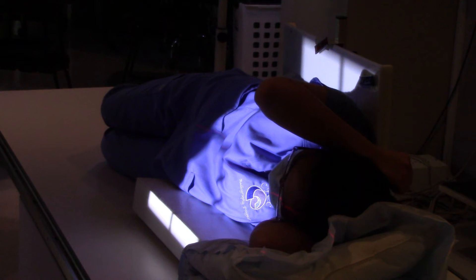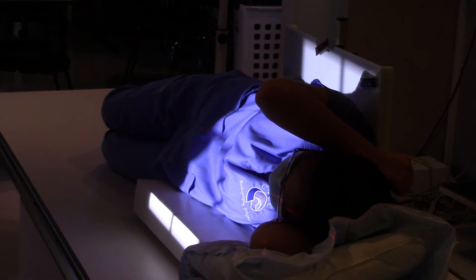Okay, so we're up and down — we're basically on the same level as the patient's neck. I can see your red laser light there on her forehead.